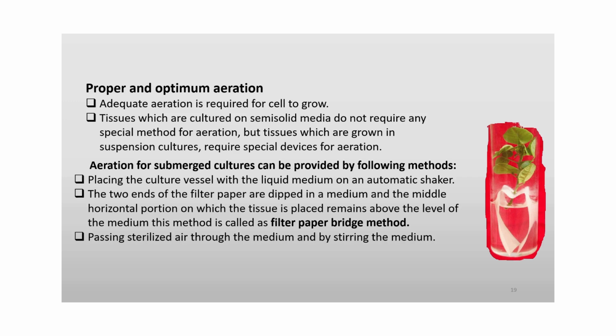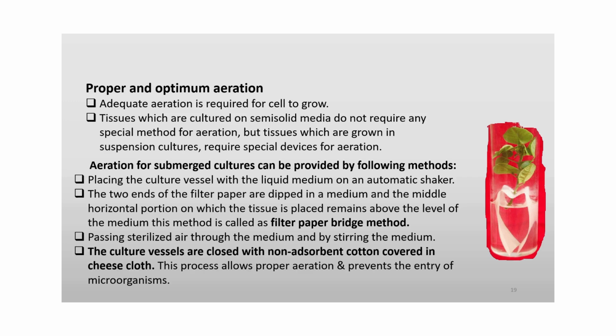Pass sterilized air through the medium and stir the medium. The culture vessels are closed with non-absorbent cotton covered in cheesecloth. This process allows proper aeration and prevents the entry of microorganisms. So you should remember the non-absorbent cotton covered in cheesecloth.